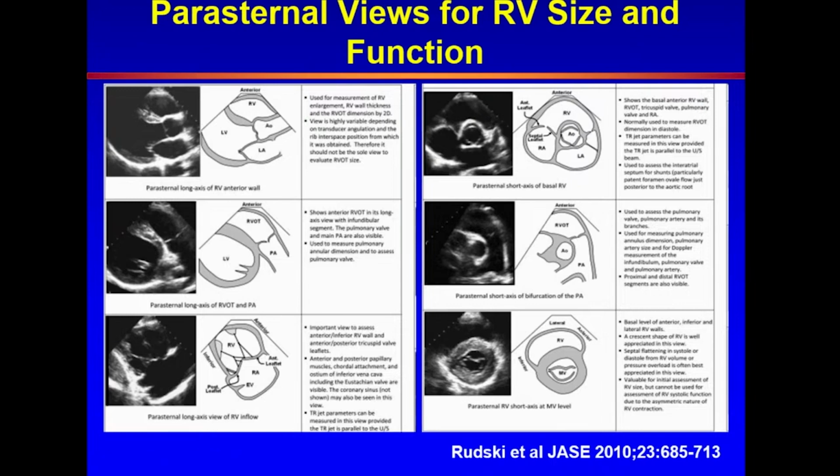as well. Certainly an opportunity to look at the tricuspid regurg and try to align with the CW signal, using CW with the direction of the TR jet. There is a parasternal short axis view that is slightly tilted higher that would get you more of the pulmonary artery and its bifurcation. This is an important view if you're looking at patients with congenital heart disease who can have supravalvular pulmonary stenosis. And needless to say, your alignments here with Doppler will be a good one.